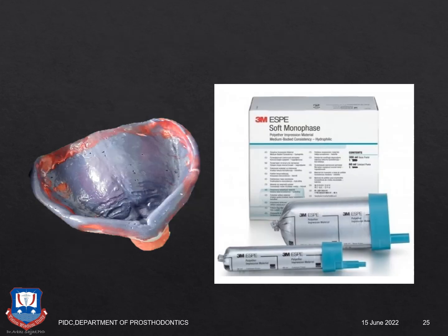And we can also use polyether monophase, that is medium body impression material, using Impregum self-dispensing guns to make a final impression, since polyether is also a very accurate impression material.